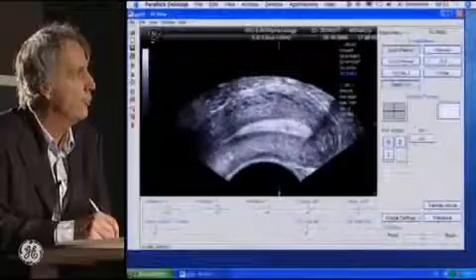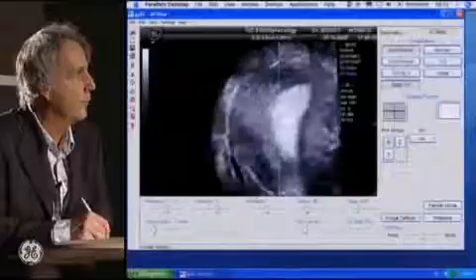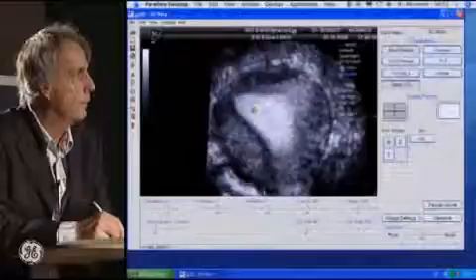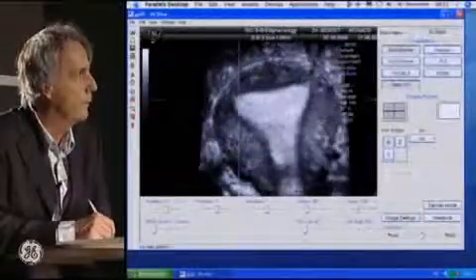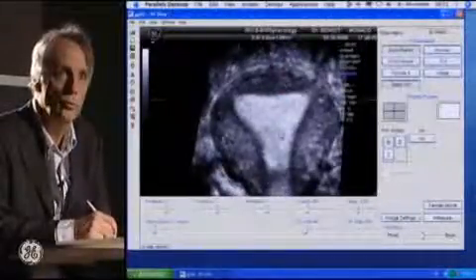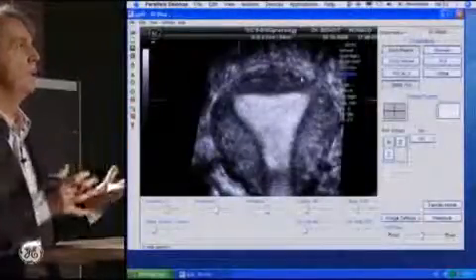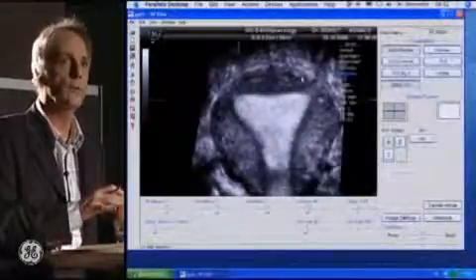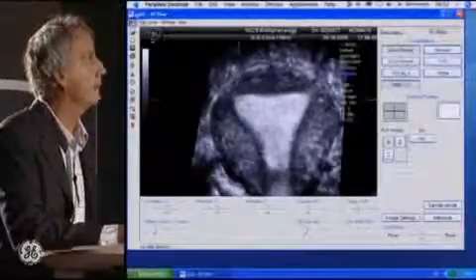After, what you have to do, you turn like this, like this, and you put the dot on one horn, you find the other one, and here you have the complete shape of the uterine cavity. So if you want to train with how to move inside the block, gynecology is really, uterus, you can start with this because you can really understand what is the C-plane.